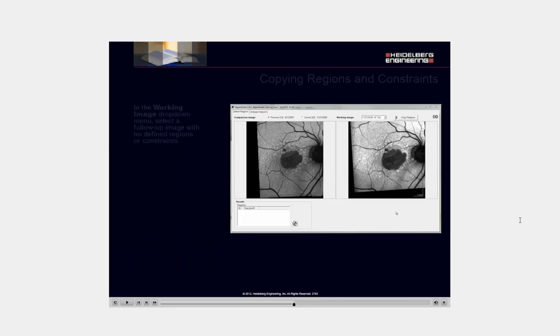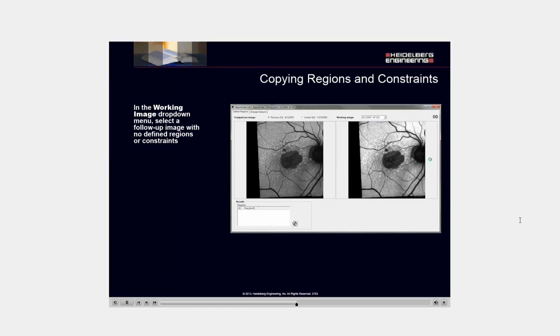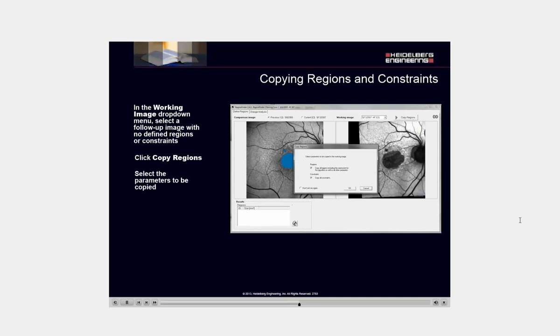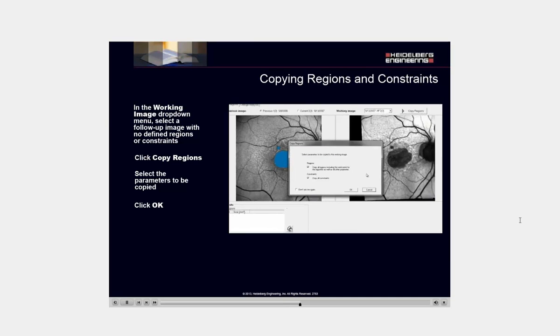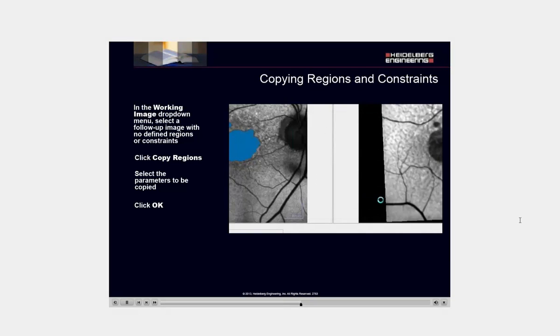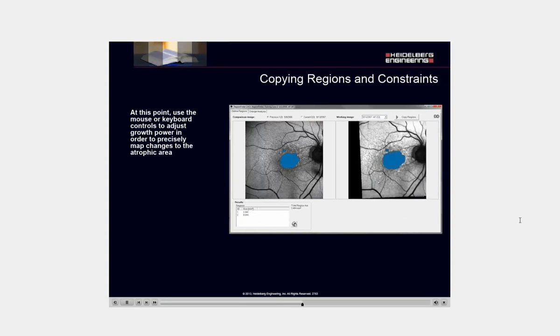In the working image drop-down menu, select a follow-up image with no defined regions or constraints. Click copy region. Select the parameters to be copied. Click OK. The software will copy the regions for you. At this point, use the mouse or keyboard controls to adjust growth powers in order to precisely map changes to the atrophic areas.